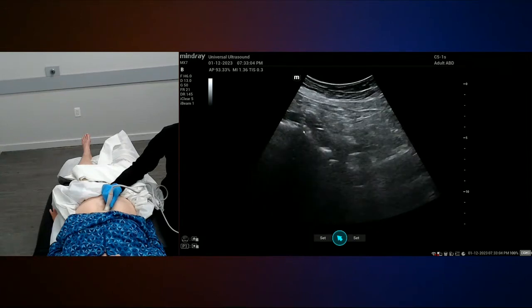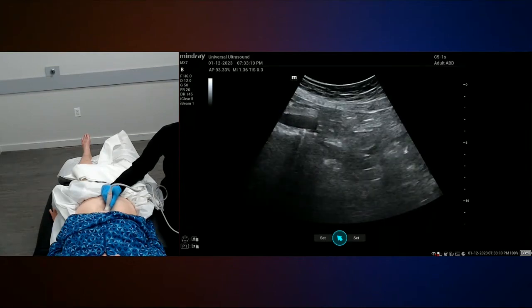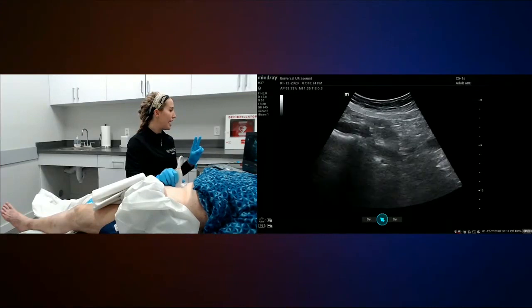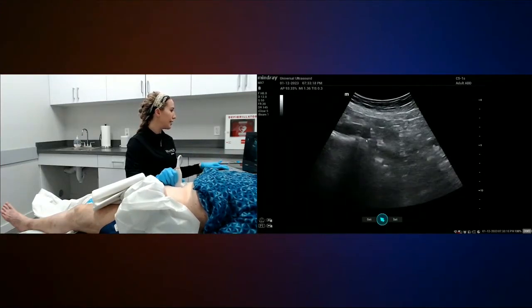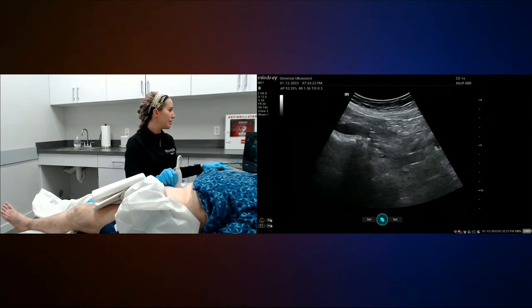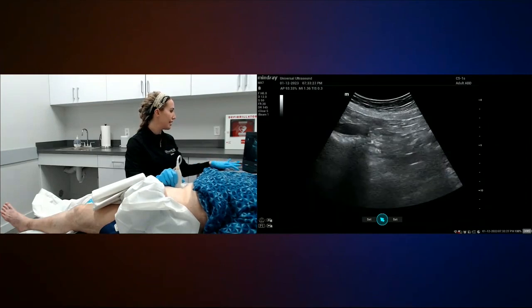And you can see in short axis, because remember, this is ultrasound, right? So we're looking at a 3-dimensional vessel 2-dimensionally, okay? So we're going to see parts of that stent. So you can see it looks short axis view here, but in reality, if you look at my transducer, I'm in the longitudinal view. So this is the IVC. Here's the right common iliac vein and the arteries on top.